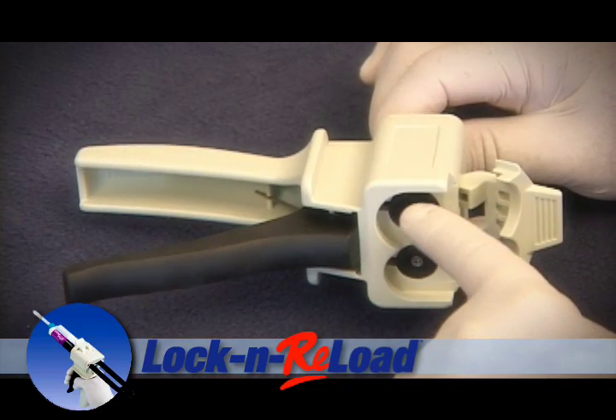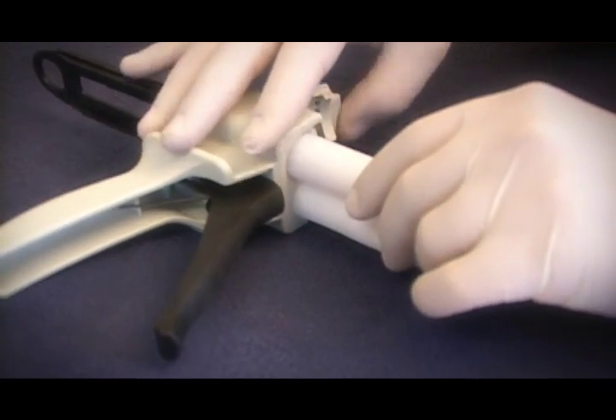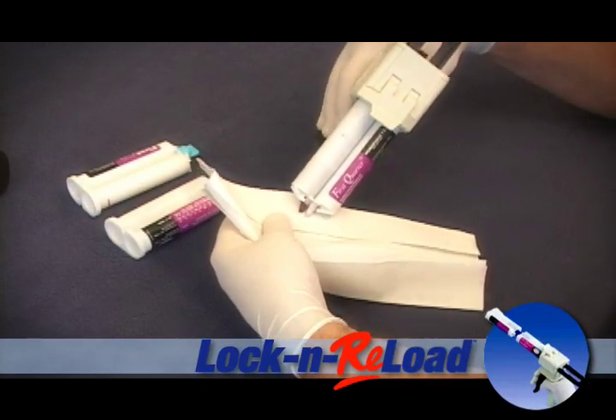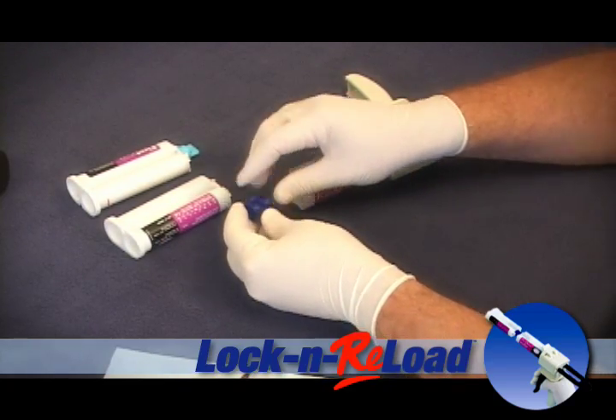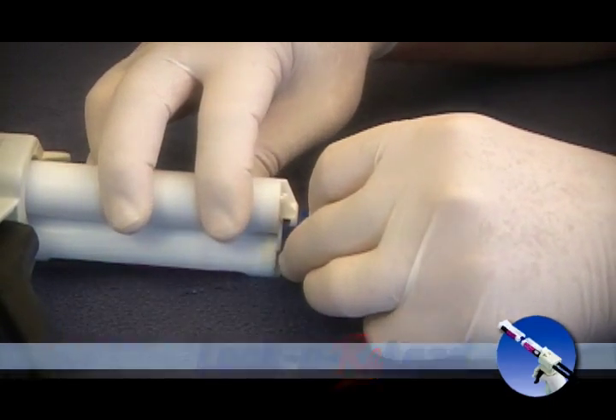You can use a standard one-to-one impression dispensing gun. Simply take a used cartridge, lock it into your gun, and sink the plunger. Take a napkin and purge out the air so you have an even amount of material. Once that is done, take your Lock and Reload Coupler and line up the tip of the coupler with a notch on the cartridge. This becomes your donor.